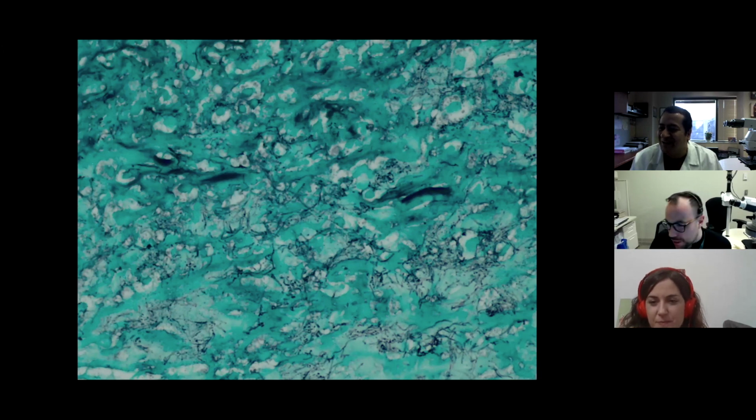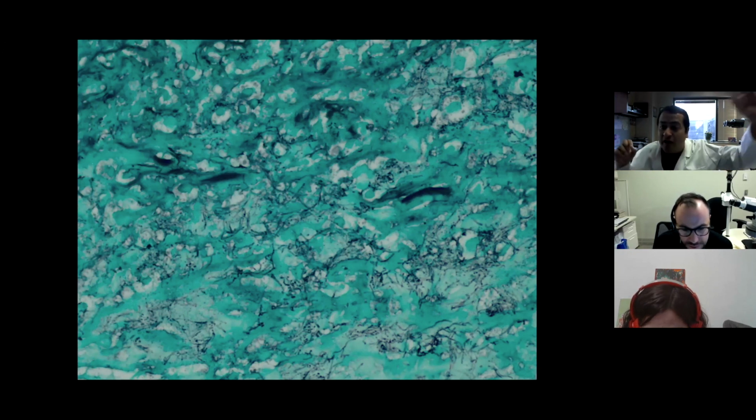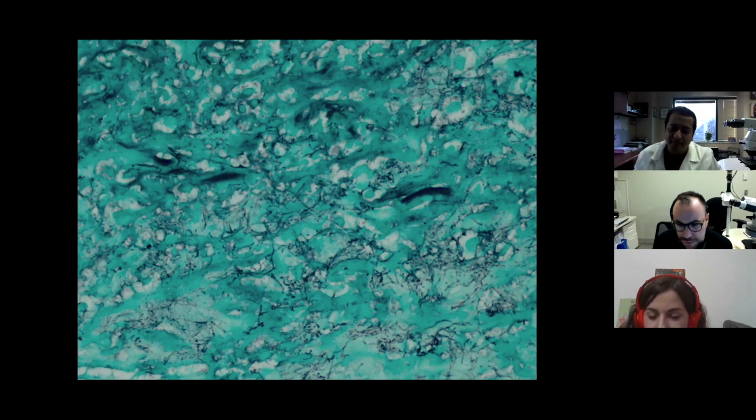I don't know how big this is. I'm struggling with the size of this. It's very, very slender and small, but long. So these are more like filamentous bacteria. Yes. I don't know, it's almost impossible that this will show up on the boards because they like to show this in an AFB stain, not on a GMS stain.